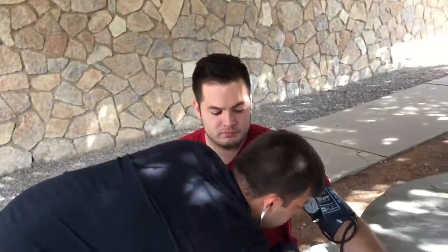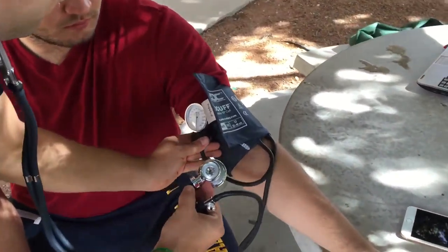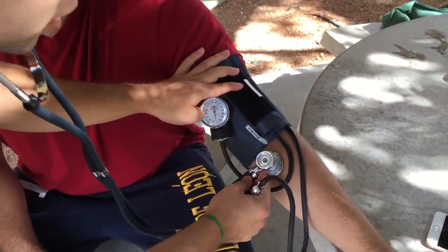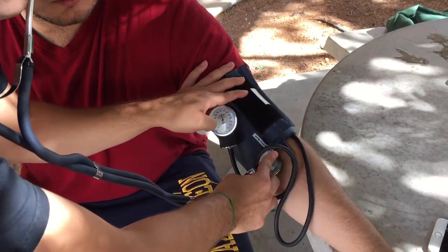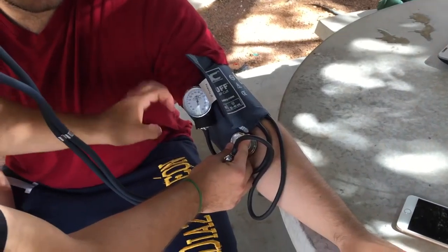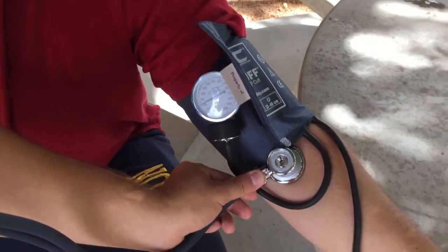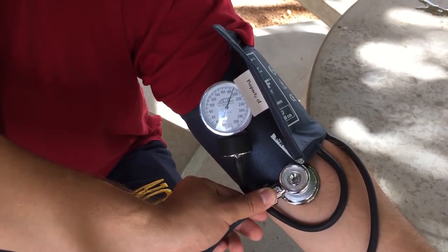Go ahead and start to inflate it. Insert the stethoscope right here against his brachial artery — it's very important that you line up the stethoscope with the brachial artery. Inflate to about 200, and once you reach 200, you're going to want to let the pressure go very slowly.